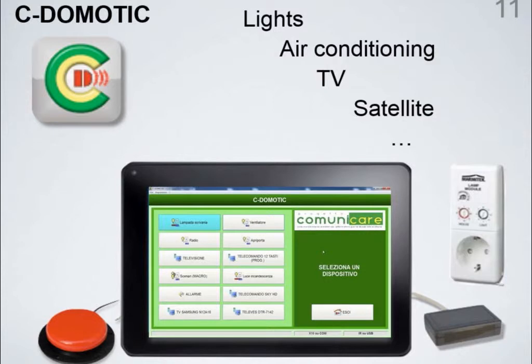The sixth app, named C-Domotic, is an application for environmental control. Thanks to an infrared remote control USB interface, the patient can control lights, TV, stereo, DVD player, and other electronic home devices, all in an easy way, just pushing a switch.